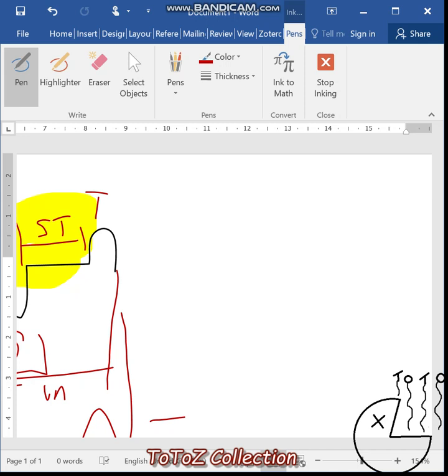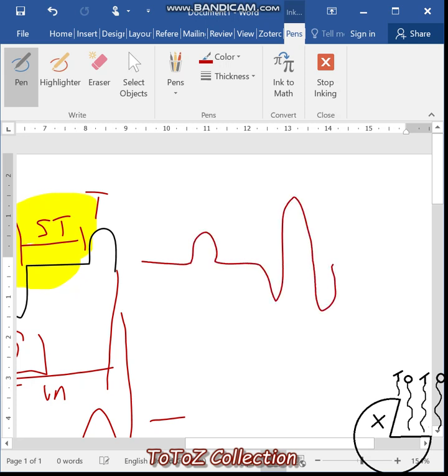So how will your PQRST complex look like? It's going to start like that, go like that, go down, go up, go down again, and then this one here is going to be somewhere there, and then you're going to have it like that. So like that is elevated. So just as we have mentioned already, you would expect to see a heart attack or angina attack elevating it like this.